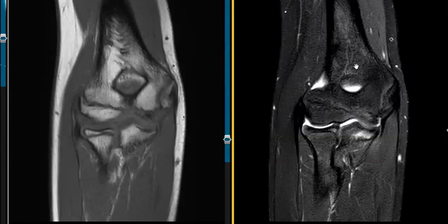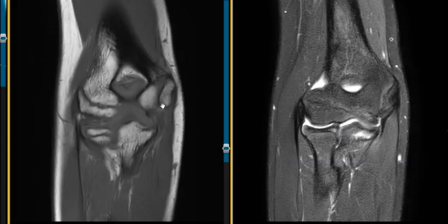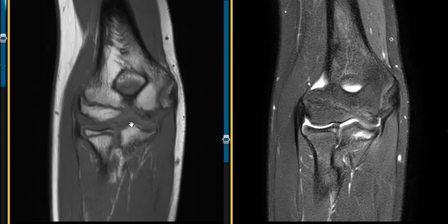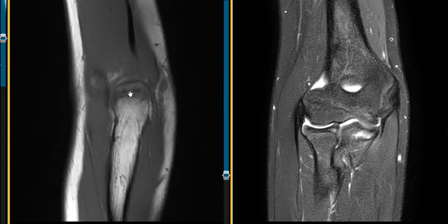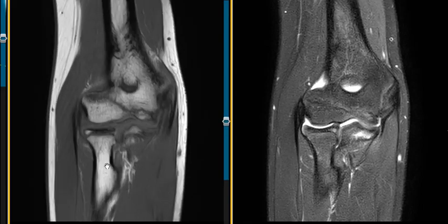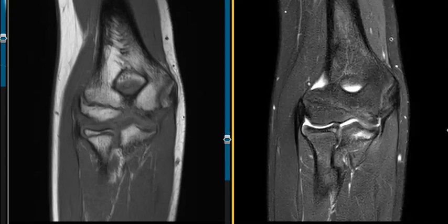Hello, this is Dr. Gay from Forsyth MRI. This is a 14-year-old male who injured his elbow throwing. He has pain along the ulnar aspect, or the medial aspect, on this side. This is the outside lateral side. For anatomy: this is the humerus up high, this is the elbow joint, and in the forearm there are two bones — this is the ulna and the smaller one here is the radius. He's having pain along this ulnar side.